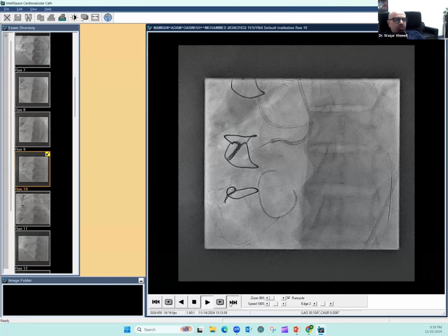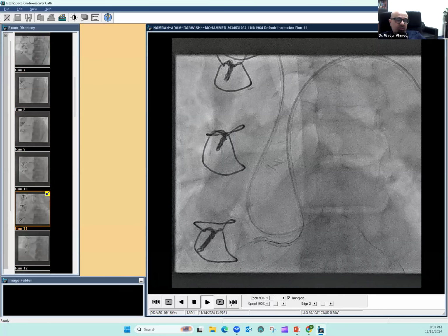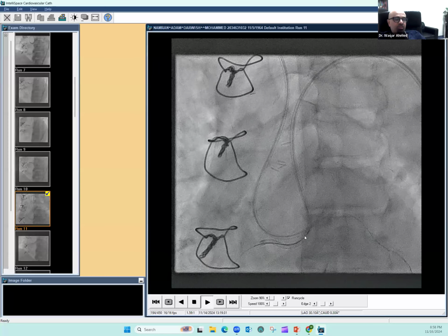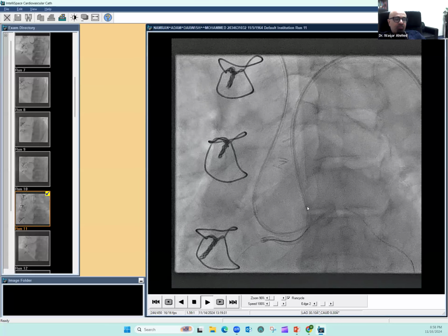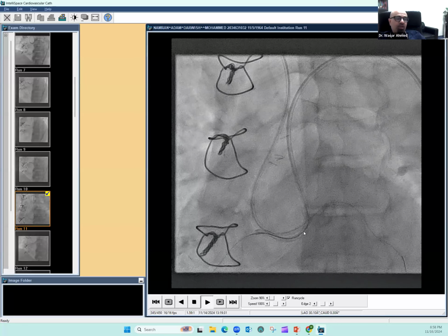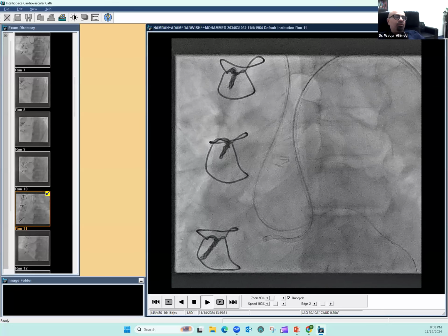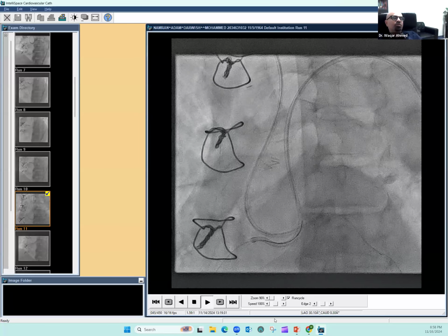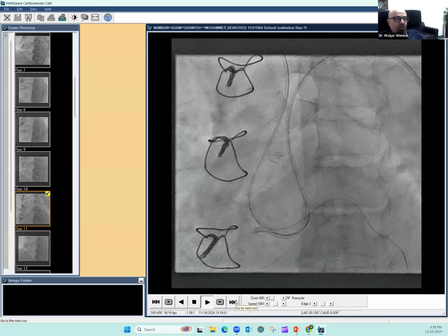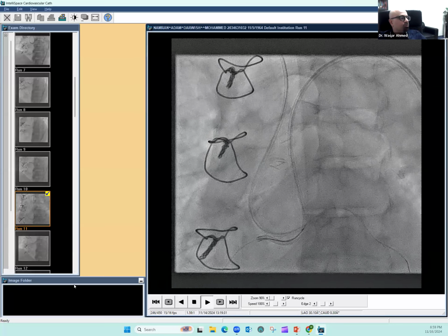I tried to be a little cute here. I did a tip-in. I did not want the epicardial collateral to have a lot of tension with a wire that's externalized. So here's the retrograde microcatheter in front of the antegrade microcatheter, and the wire is going from the retrograde microcatheter inside the antegrade microcatheter inside the guiding catheter. So once it's in, then here's the wire going up from the retrograde microcatheter to the antegrade microcatheter. But unfortunately, once I came down, I could not push it through because the CTO was pretty tough there. So I had to externalize. And let me go to number 18 now.